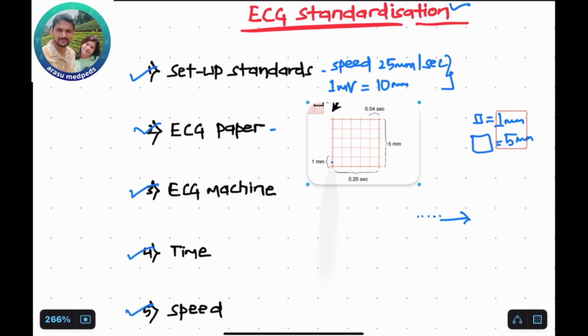As of now, don't focus on the timings, just understand they got a paper with small and large boxes. So this is the idea about ECG paper.